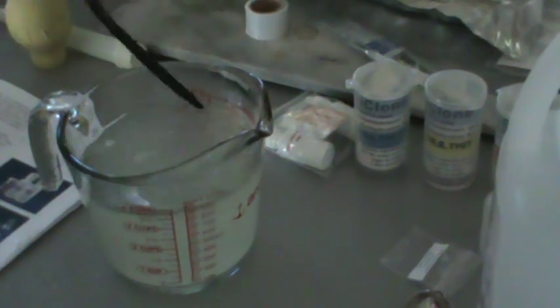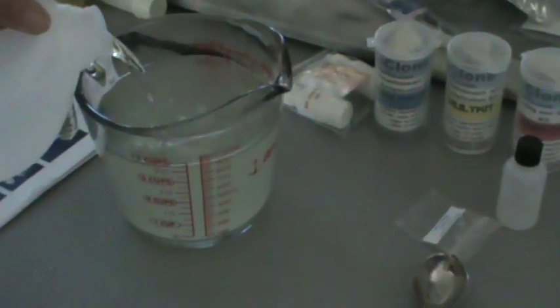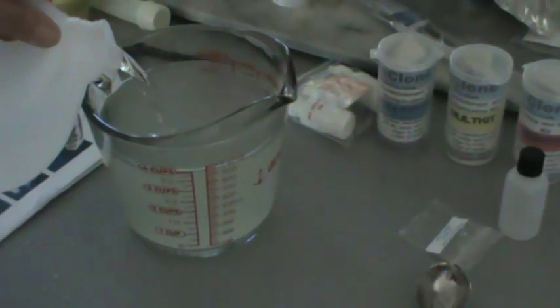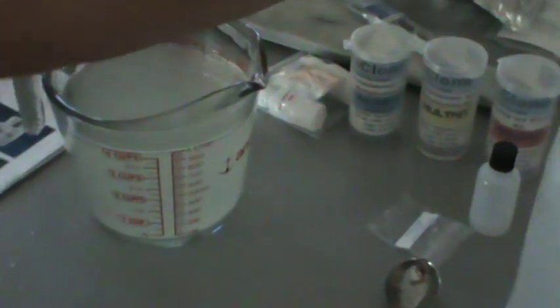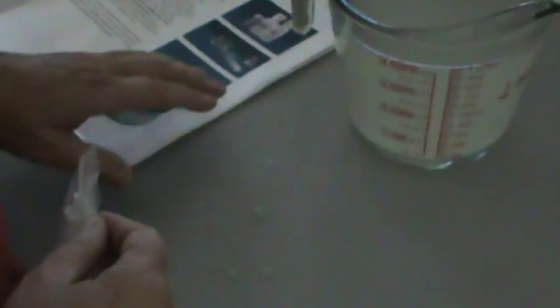Now I'm going to fill that up to one liter. Guess who didn't bring home their pH meter — so I'm going to use these pH strips. I hate these strips. There's pH down and there's pH up.